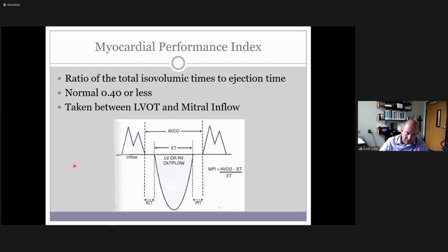And as a note, this is just my personal preference, my OCD, I suppose, kicking in. Just for accuracy, if you're reporting numbers with a decimal, always put a 0 before the decimal. Especially if you're handwriting a report and you just put point this or point that, the doctor or whoever's interpreting it may not notice the decimal, and that significantly changes what it is. So just as a mathematical habit, always put a 0 before a decimal.